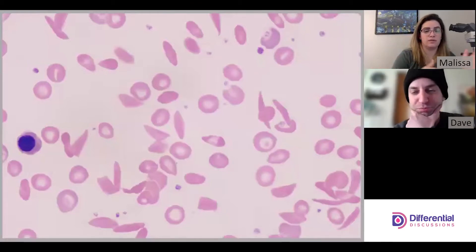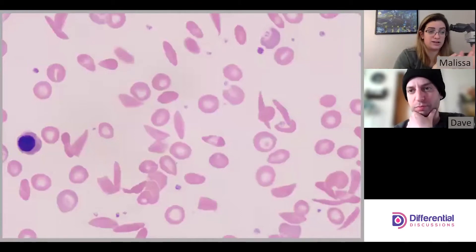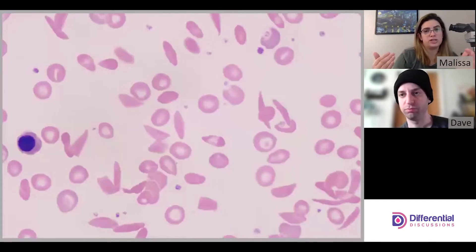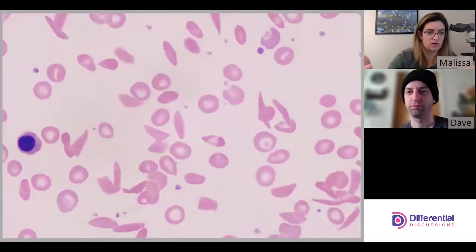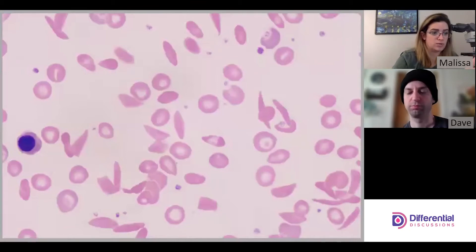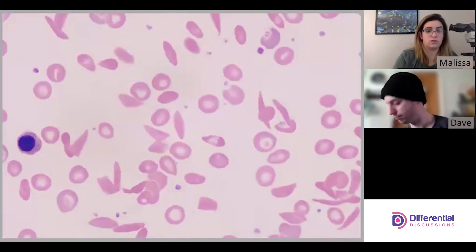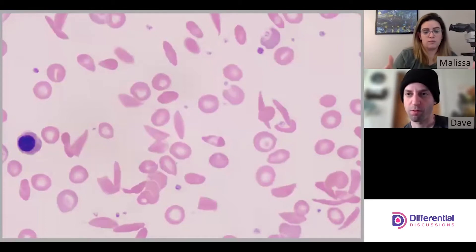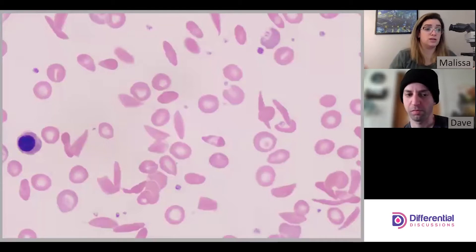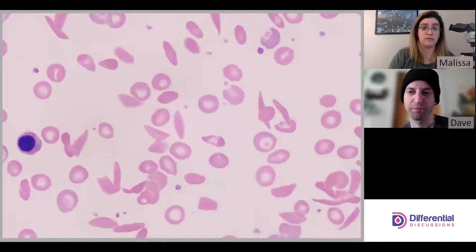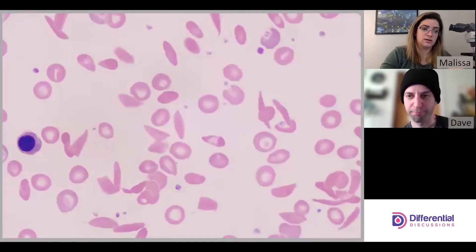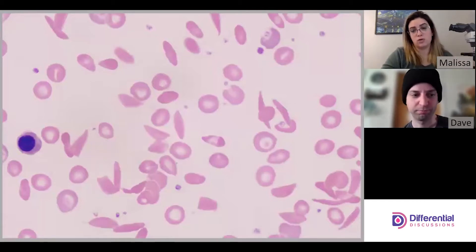The number of nRBCs you'll have to count differs depending on whether you're using an analyzer or doing it manually. Typically each institution will say you must count a certain number of nRBCs and then correct the WBC count. For example, if you're a tech in the field and you count four or more nRBCs beyond what the instrument got, you may need to correct the WBC. The reason is that instruments — especially for really immature nRBCs — count them as white cells.